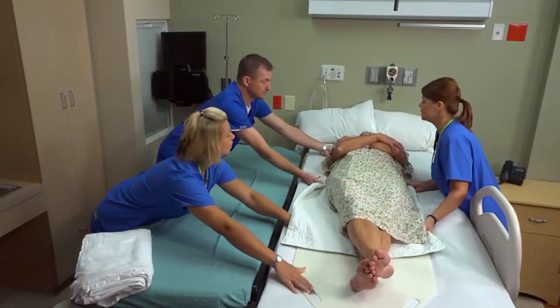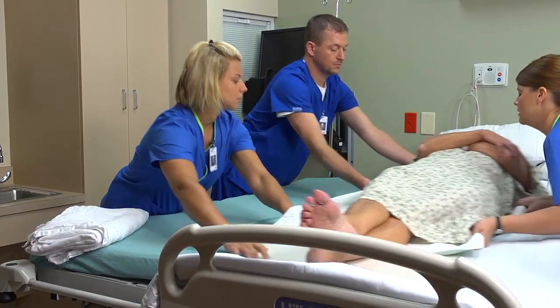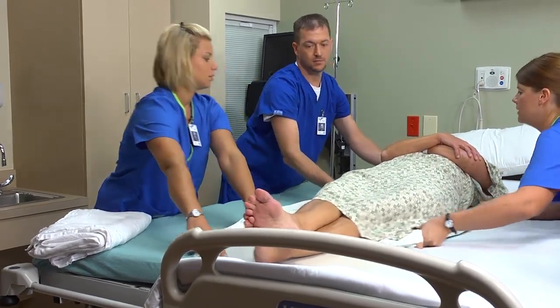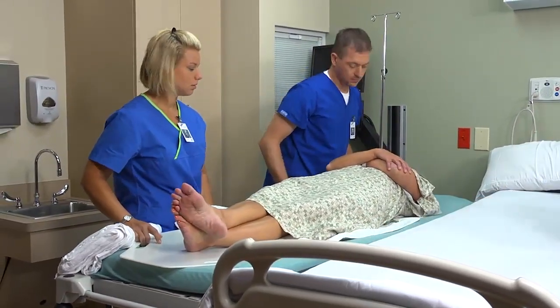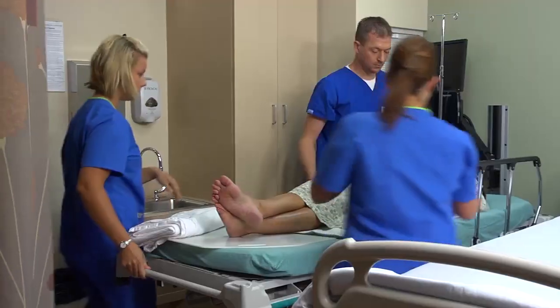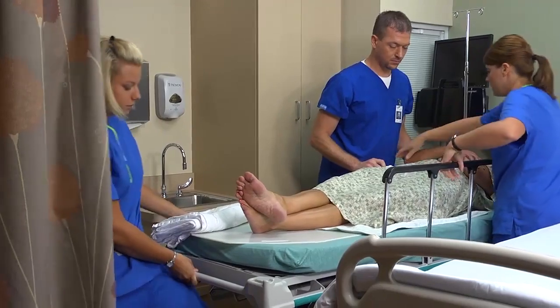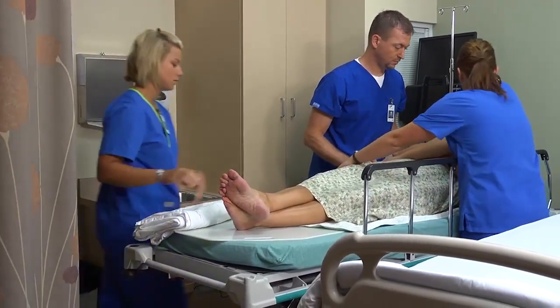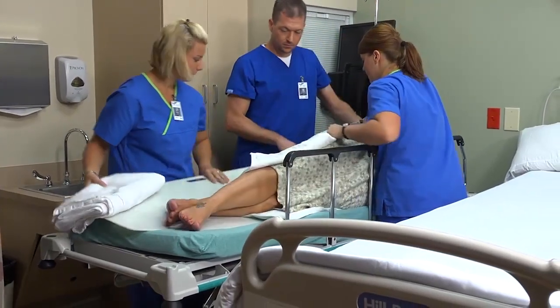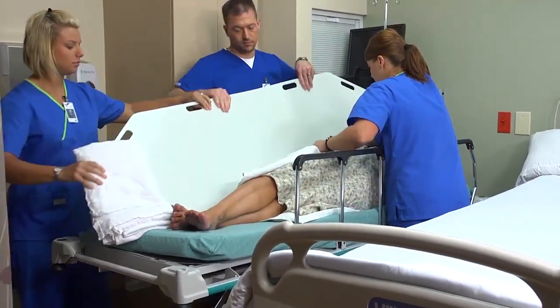On the count of 3, pull the slide board with the patient onto the stretcher. We're going to go all the way over. 1, 2, 3. Then position the patient in the center of the stretcher and remove the slide board from under her. Count of 3, we're going to pull you over and take the slide board out from underneath you. 1, 2, 3. Okay, and back down.